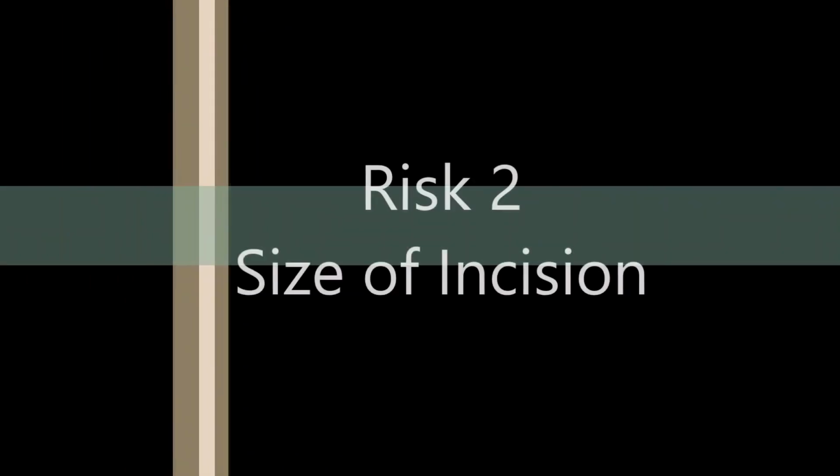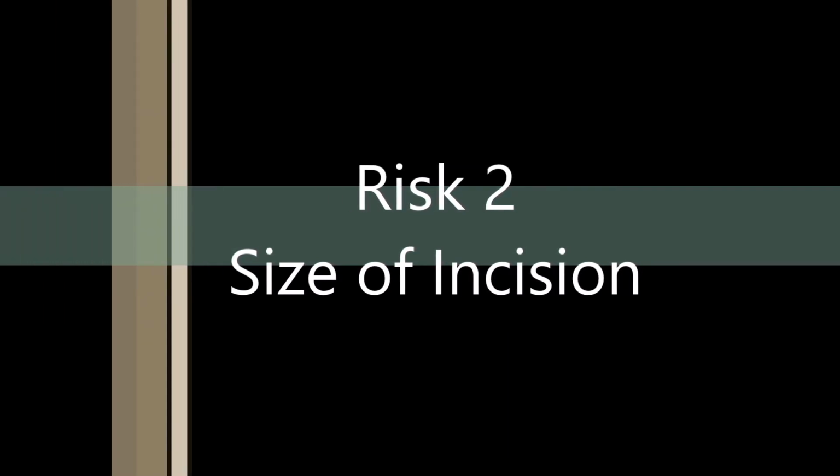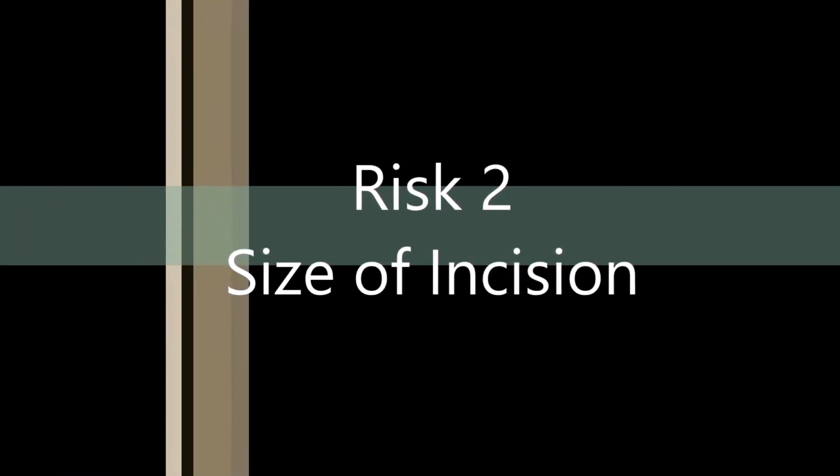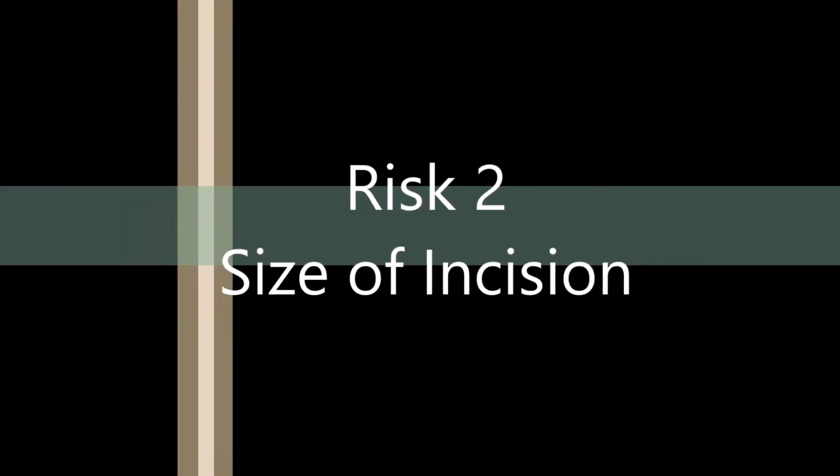However, the procedure is risky. Firstly, because the hamster is old, the healing process after the procedure will be very slow, and there is a risk that the hamster might die during anesthesia. Secondly, the stitch size would be very large for the hamster. After all, if a human had a tumor proportionately as large, it would stretch from the armpit to below our waist. Considering these risks and after getting the permission of the owners, we went ahead with the surgery.